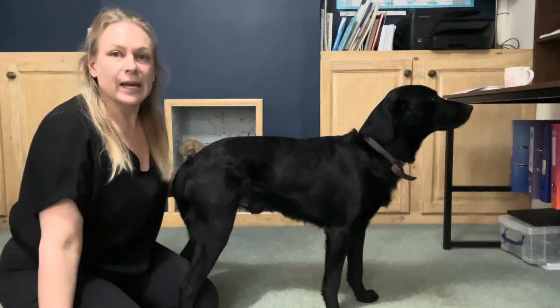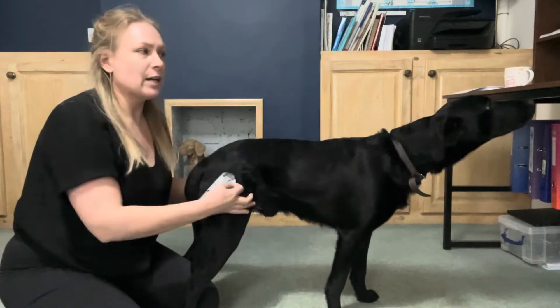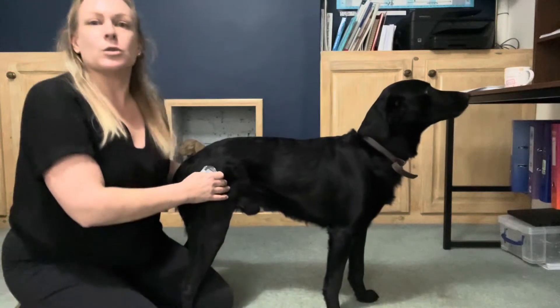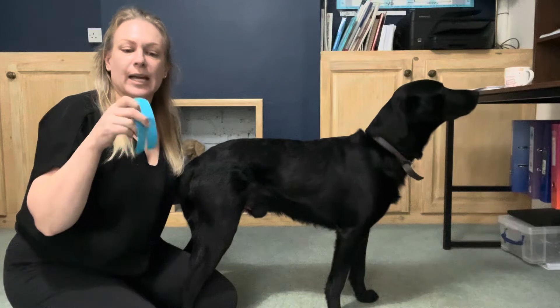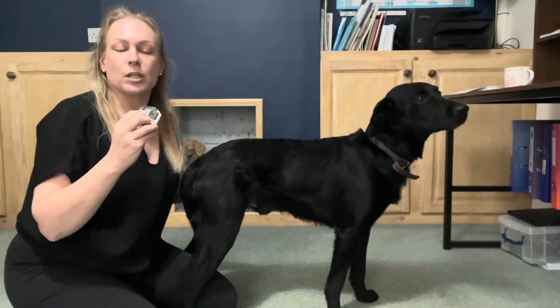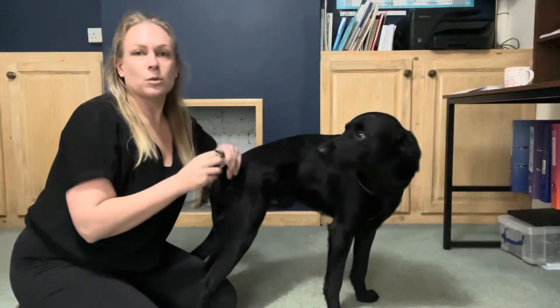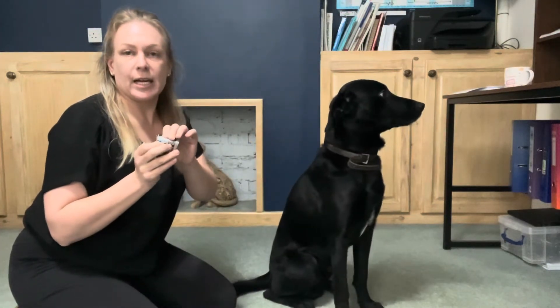What you need to do is prepare your tape first. You're going to cut a strip into the Y configuration, and then just make sure that you've ripped and torn the back of the tape here so that you're freeing up the fingers of the Y.